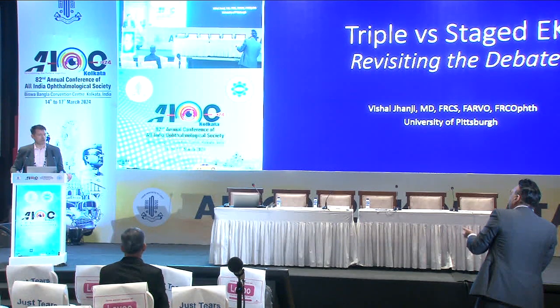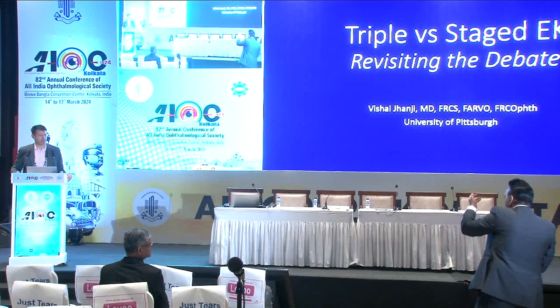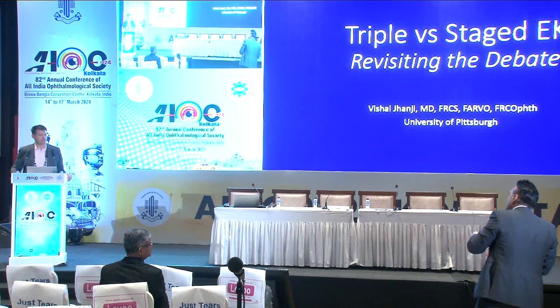And the technique you're using is a forceps-assisted insertion? Exactly. So Divya's video that she basically showed yesterday. Yeah, so basically just endo in, obviously we use the EndoGlide 27-gauge forceps and pull it in. You'll never get that because your AC is going to be super deep when you basically pull it in. So you avoid all these issues of shallowing.